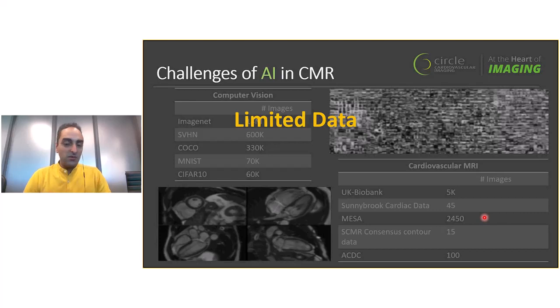There's pathology cases. Most of the UK Biobank cases are healthy volunteers, right? So they're like general public, right? So you don't necessarily have representative information on people who have hypertrophic cardiomyopathy, for example, or other types of diseases that change the shape of the ventricles. Like, for example, pulmonary hypertension, where instead of the left ventricle looking like a donut, like a perfect circle, they may look like more oblong ovals or something like that. So it's a huge challenge to get a representative set of data to train on.